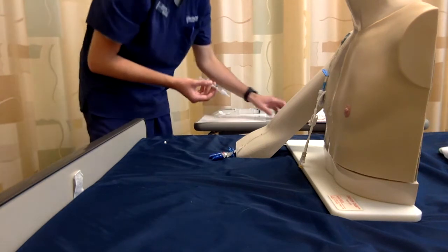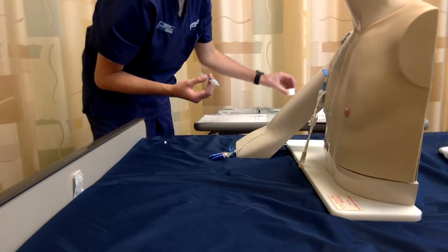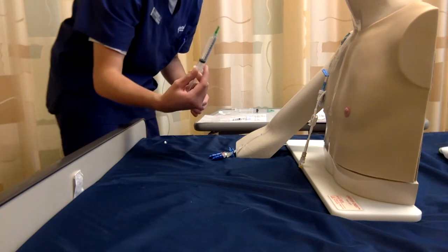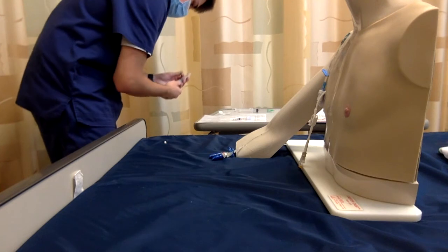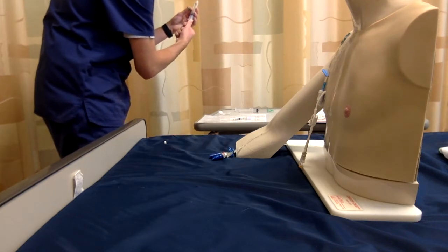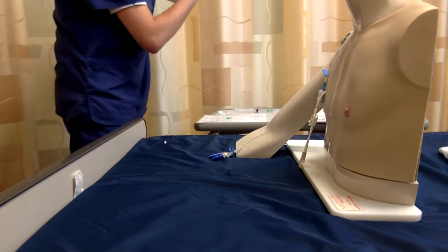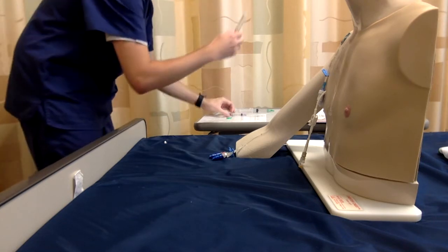I checked the Betty book again for any compatibility. It's compatible with his medications, and it says to dilute it in some saline. So I'm going to get my 10 ml flush. Get the air. Dilute my medication.